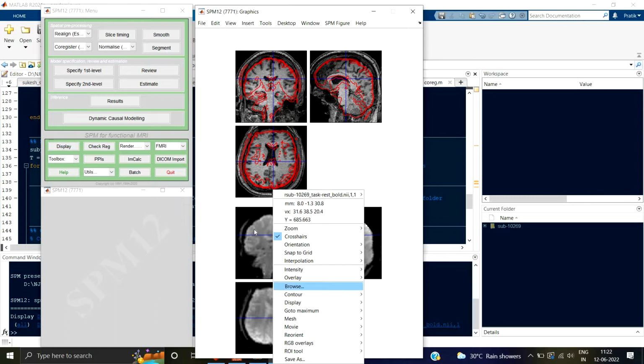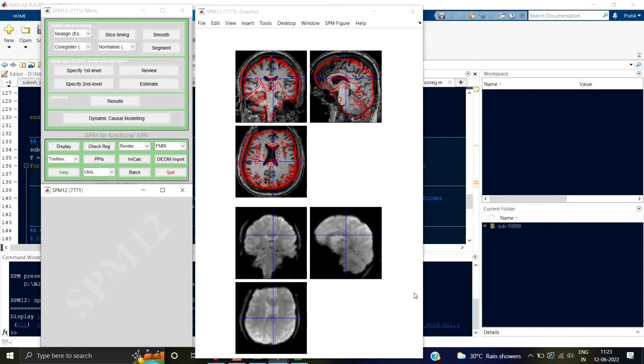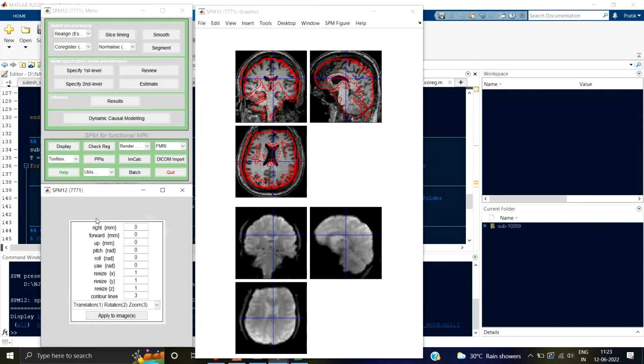So I just want to reorient this functional image. When you do that, you get an option over here. You can move right, forward, up. Then you can rotate in the pitch direction, roll direction, yaw direction, and you can also resize, that is, make it bigger or smaller. So these are the different parameters that you can use. However, we just want to move the functional image up. So we'll use up and just try and change this and see what happens.